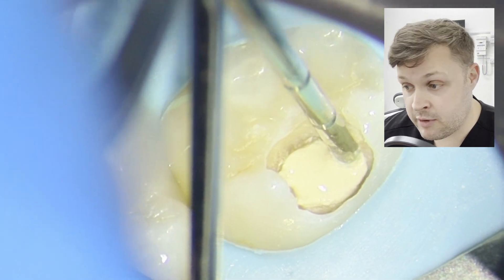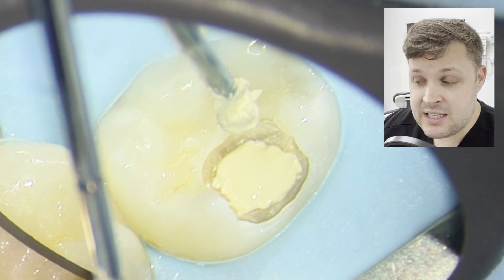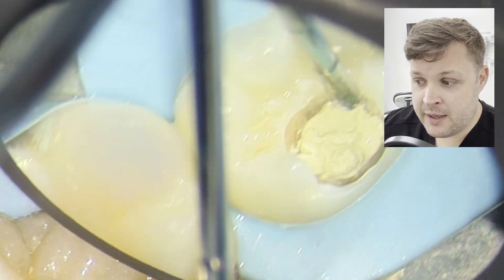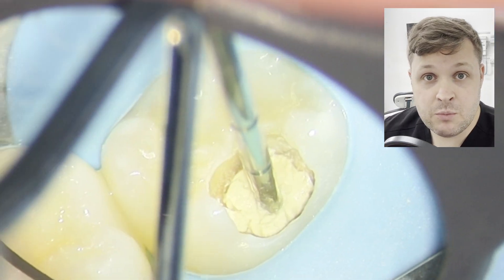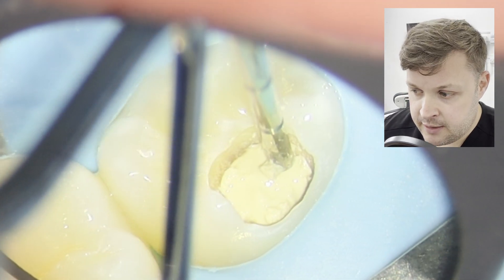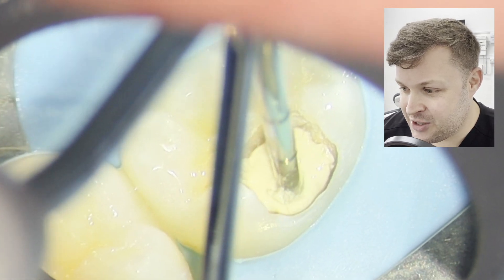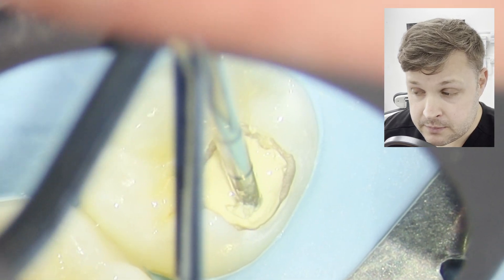Biodentin is really technique sensitive — you have to be super careful. As I've mentioned in other videos, you want to put it in, dampen it down a little bit, maybe add a little more, but don't over-manipulate it. If you muck around with it too much the Biodentin will just pull away from the cavity, which is super annoying. Put it in, dampen it down, don't mess with it too much, and just walk away.